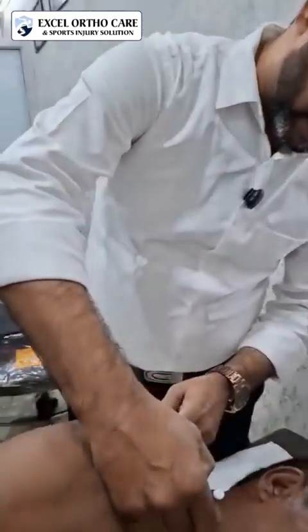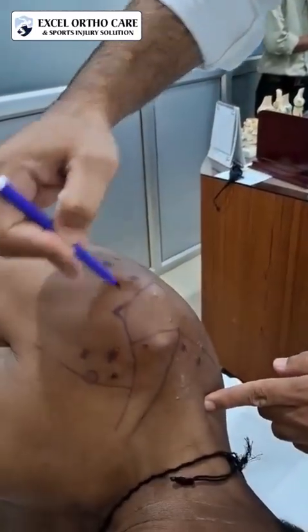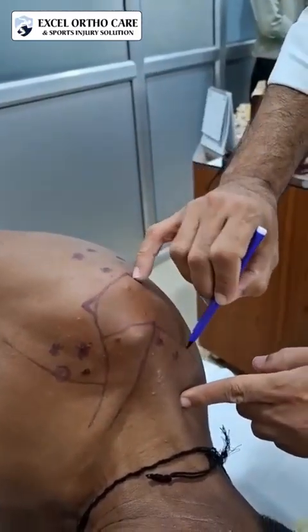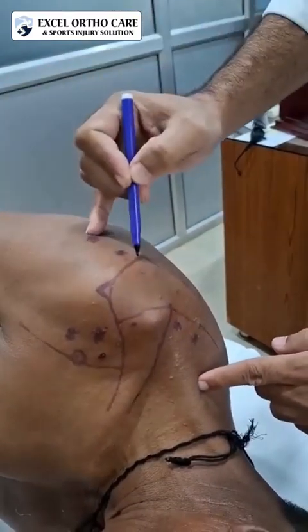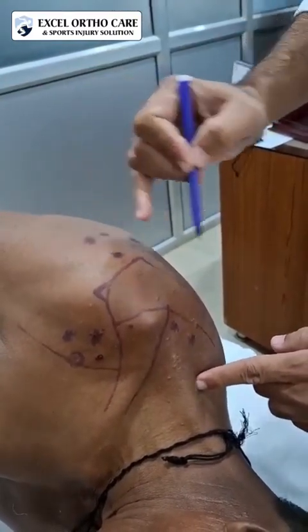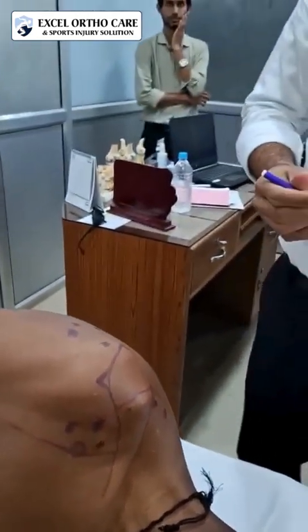This one is the clavicle. This one is the acromion. This is the spine of scapula. This is the anterolateral corner of acromion. This is the posterolateral corner of acromion. So let's get started with portal placement.